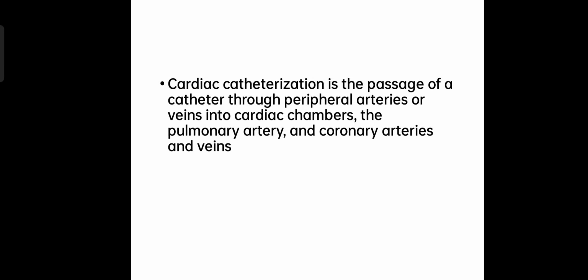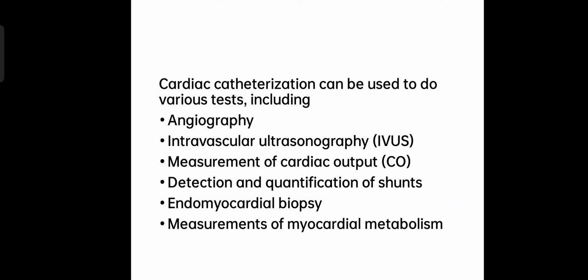Cardiac catheterization is a passage of catheter through peripheral arteries or veins into cardiac chambers, the pulmonary artery, and coronary arteries and veins. Cardiac catheterization can be used to do various tests including angiography, intravascular ultrasonography, measurement of cardiac output, detection and quantification of shunts, endomyocardial biopsy, and measurement of myocardial metabolism.